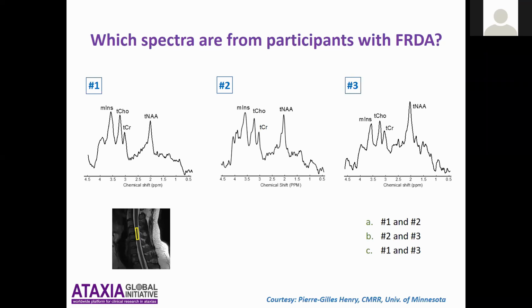Okay. So is it 1 or 2 or 3? 1 and 3. I would like to say there are no bad answers, but of course there are. In this case, there's one right answer, yeah. But just think about the neuronal marker I was talking about, the glial marker, and pattern, the ratios of the different peaks to each other. Right, let's see how our audience did.